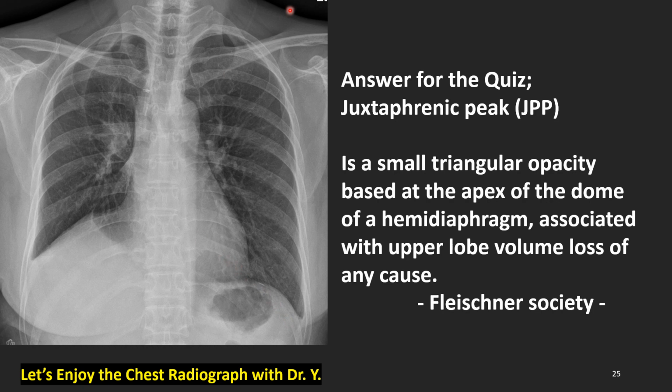Now, the study of session 10 is ended. We studied very important and hard stuff of chest radiography, lobar anatomy, and pneumonia. That is very, very important. We must praise ourselves for our hard effort. Yes, let's be light about this quiz.